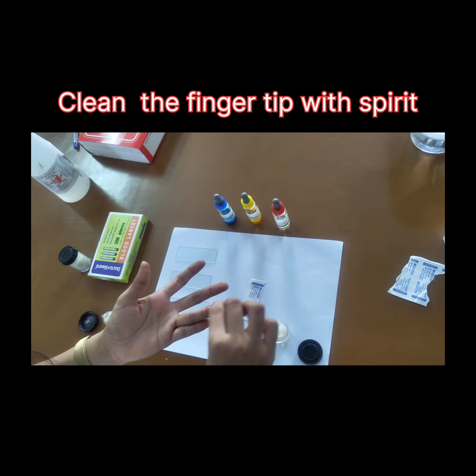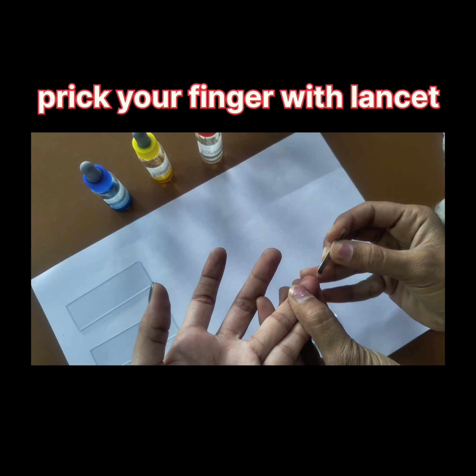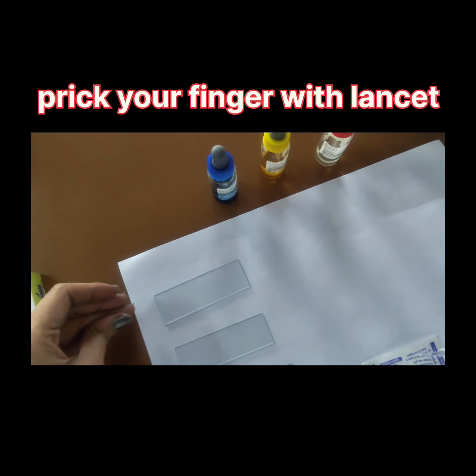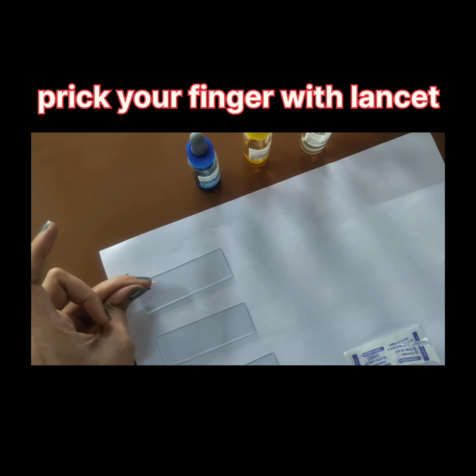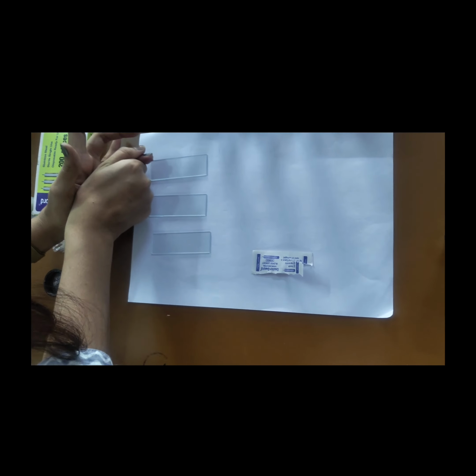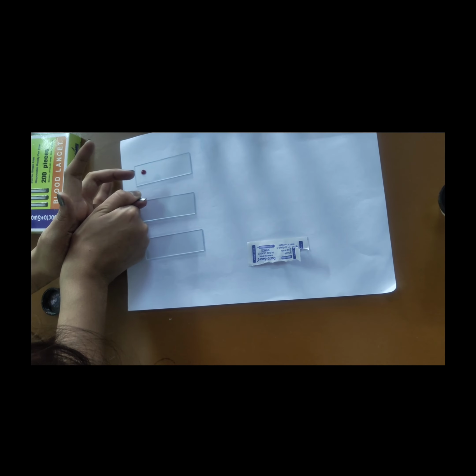First of all, clean the finger with spirit swab. Then after, prick your finger with lancet very carefully. Here we require only 2 to 3 drops of the blood. If blood is not coming out, you need to do milking process. By this you can get enough amount of the blood.